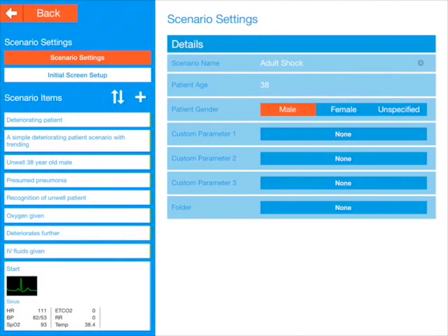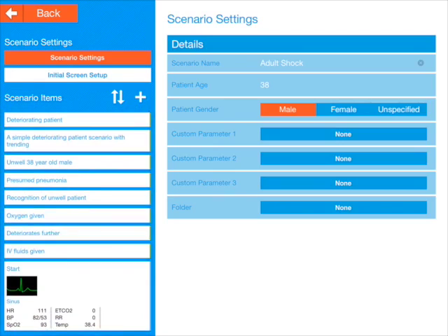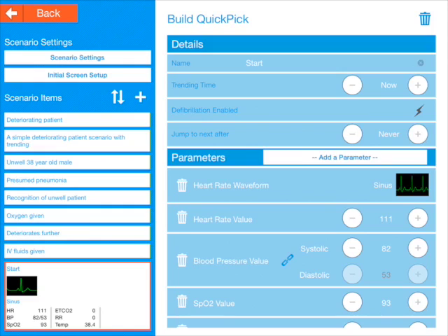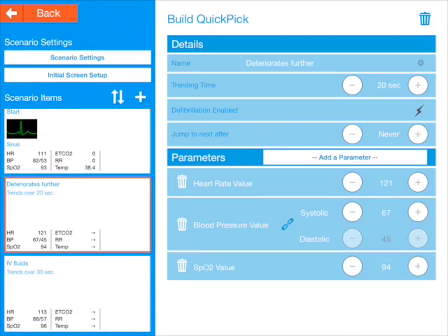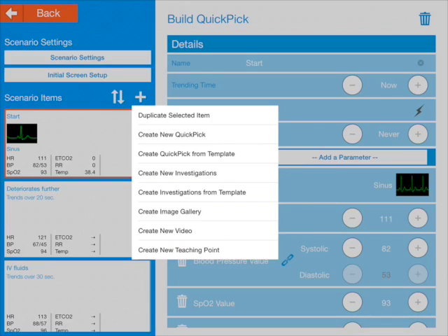Here we are in the Adult Shock scenario, and you can see down under scenario items we've got quite a few things added already. The words are teaching points, and there are the QuickPicks themselves, which alter all the parameters on the screen. Using the plus button here, there are a lot of options, but we're going to create an image gallery.